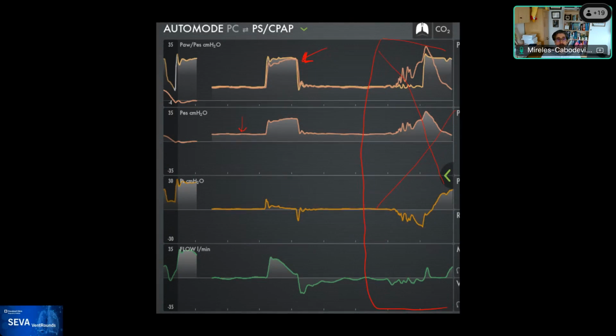When you're looking at the balloon and you're advancing it, and it goes into the airway, you're going to see an equalization of the pressures. If you're in volume control, you're going to lose the resistive step up, that little initial step up that occurs. But if you're in pressure control, they will look like it does here, almost identical.